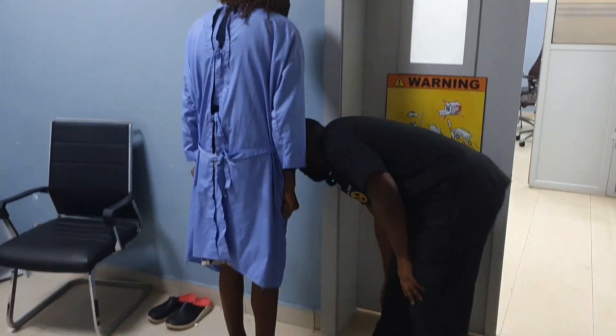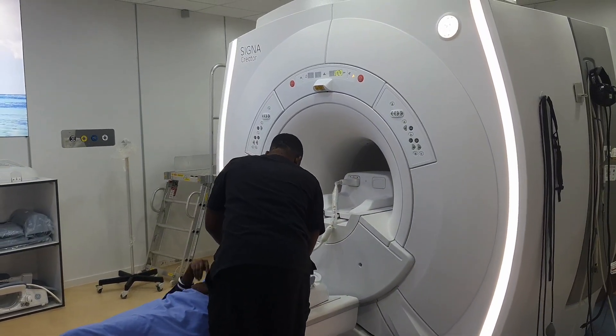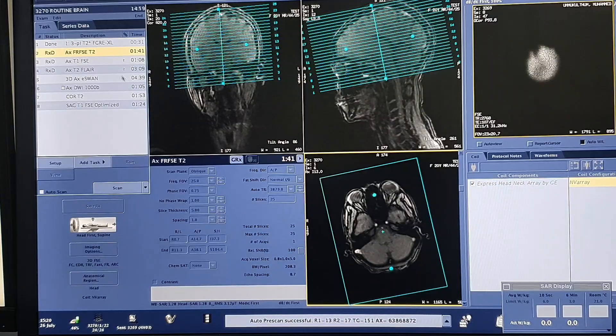Hey fams, in case you've seen this face for the very first time, I am the Celebrity Radiographer and on today's series, I will show you how to carry out a step-by-step brain scan using the GE 1.5 Tesla MR machine.